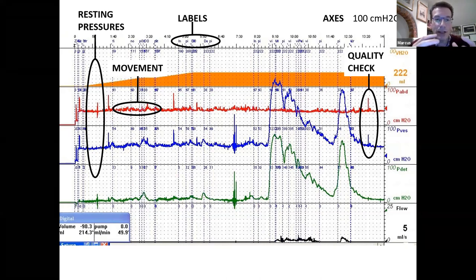Now the rectum is a contractile organ, but that is going to cause a rise in pressure that looks like a phasic rise, a little hummock. So a contraction in the rectum actually doesn't really look like this. A flush has also been suggested, but the flush, the syringe, generates a hell of a lot of force that goes straight across the transducer, tends to look extremely big, and tends largely to be upwards with no downwards component. So actually what this little blip is, is that something's just knocked the line, given a little nudge. Perhaps as the patient moved, it slipped off the patient's knee or something and landed on the couch. So there's just a little flick, and hence there's an upwards and a downwards component, which is not biological. It's that the tube's got a little gentle nudge.